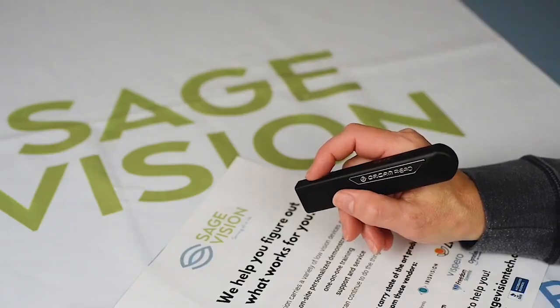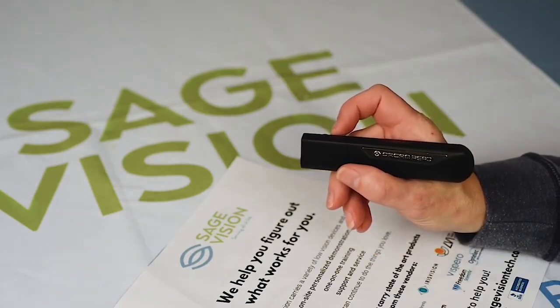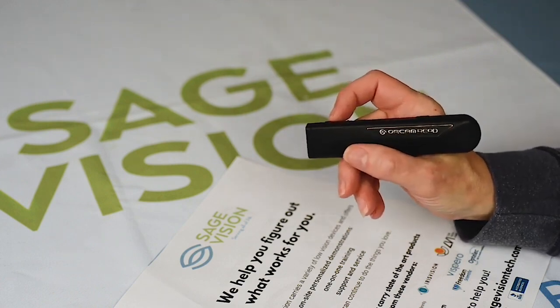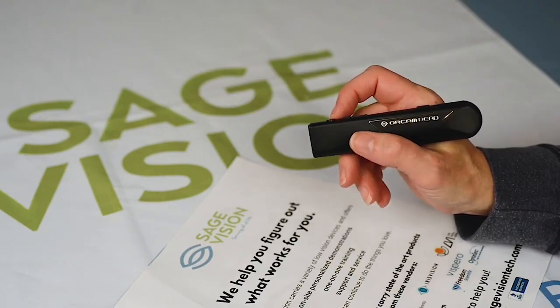Hello and thank you for joining us today. This device is the new OrCam Read. SageVision is the proud OrCam dealer for Pennsylvania. The OrCam Read does just that — it's very simple and easy to use. I'll show you.